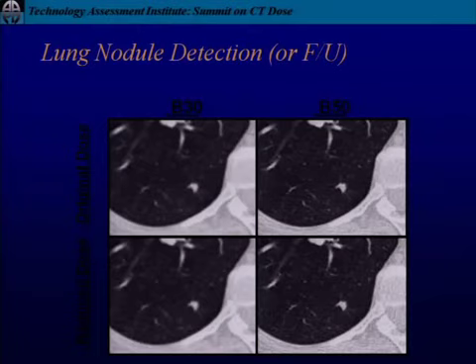For those of you not familiar with Siemens, this is a little bit smoother, a little bit sharper, and I think you can appreciate that in the depiction of the anatomy in this image. Here's the lesion. You can see it's a little sharper there, and that's probably your best look at it. That's the higher dose and the sharpest kernel. Now, if you're looking for the lesion, any of these would be adequate, right? You can find it. If you're looking to characterize it or see if there's progression from the previous scan, this might be a little tougher with some of these looks.